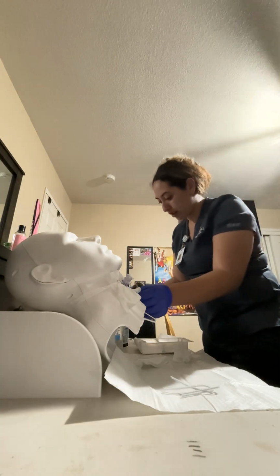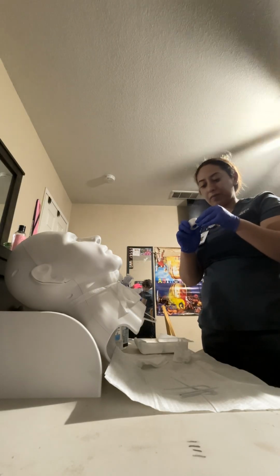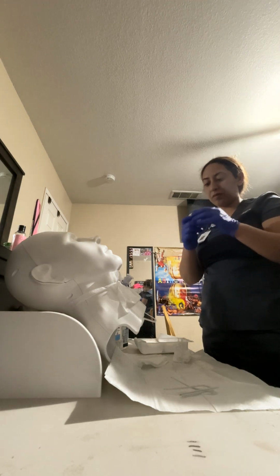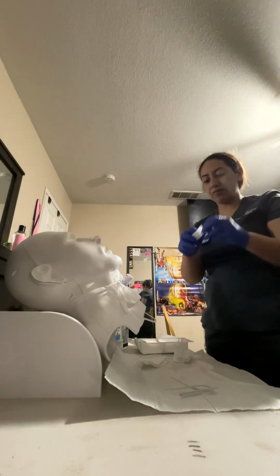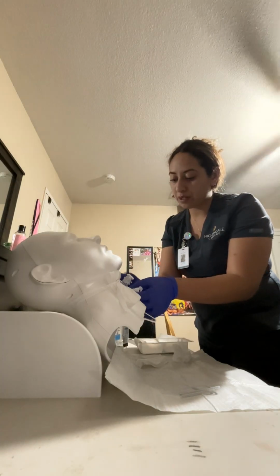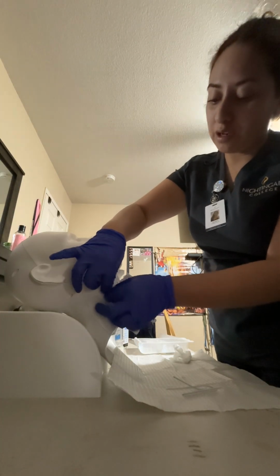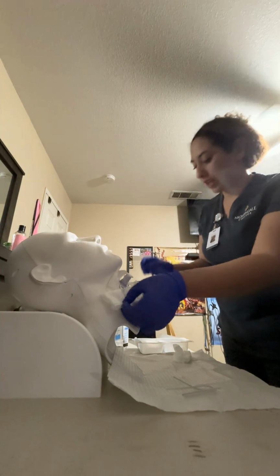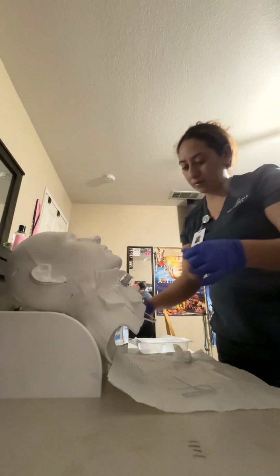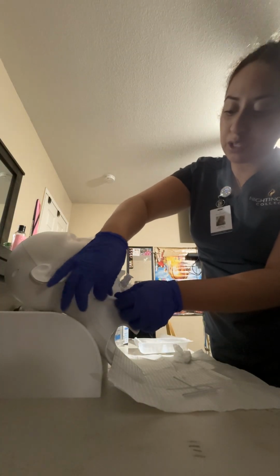So I'm going to do this side first. And apply a little tape. And there we go. We will tape that down. I have another 4x4. We're going to place this here around that knot. We're going to fold that down, and with another piece of tape, we are going to close the end there. Okay, so now we have completed tracheostomy care.